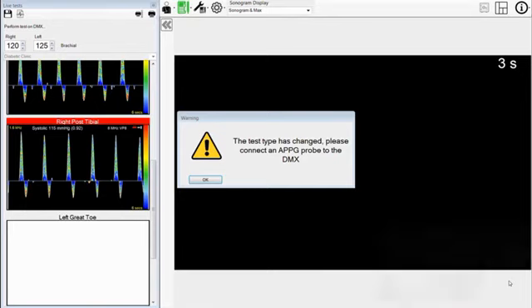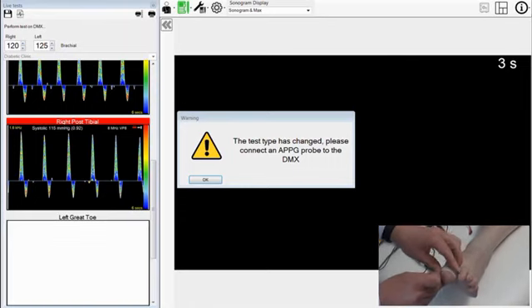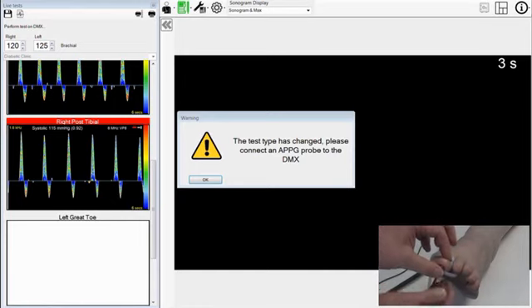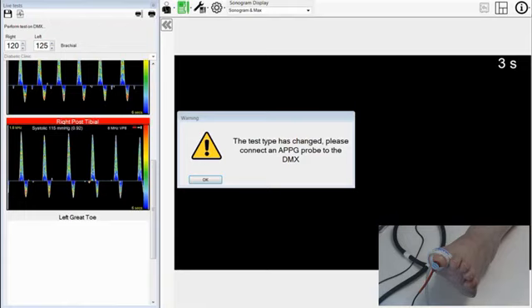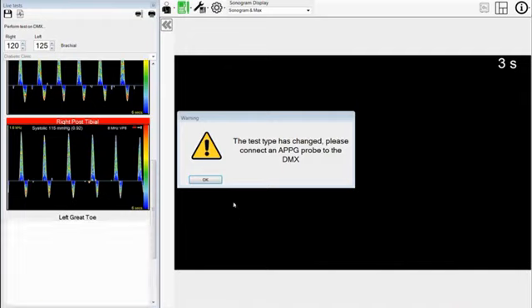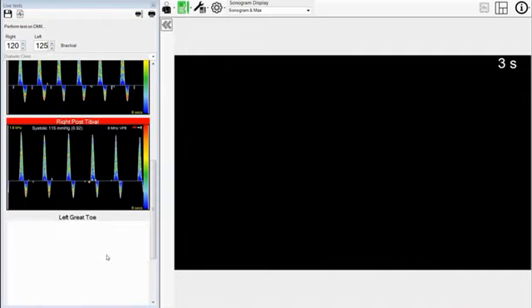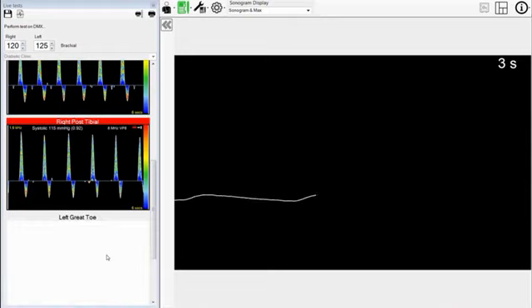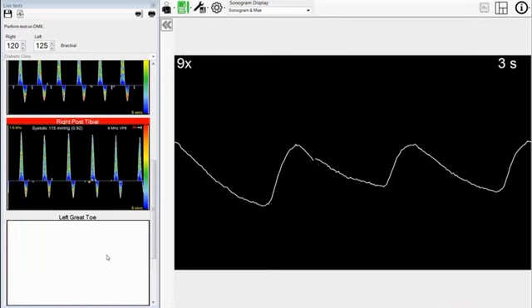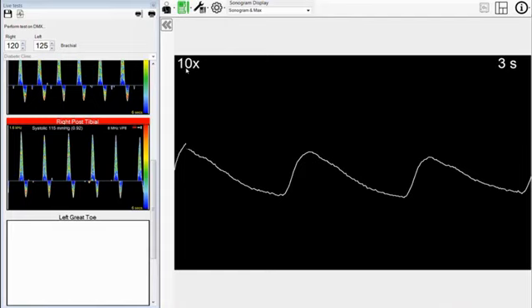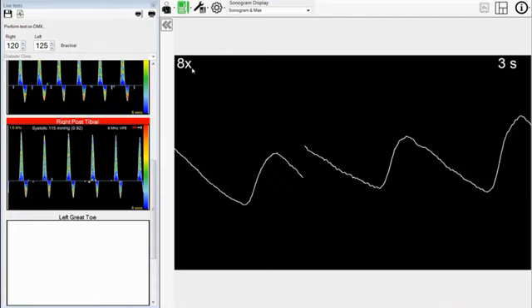After we have set up the PPG system, we place the toe cuff around the base of the great left toe. Then attach the PPG sensor to the end of the great left toe. We are now ready to measure the left toe pressure. Press OK and now we can press the green arrow on the Doppler. You will see the trace move across the screen, and this will change for the gain setting shown on the top left hand side of the screen. The higher the gain setting means that the signal is weaker and the blood flow is smaller.